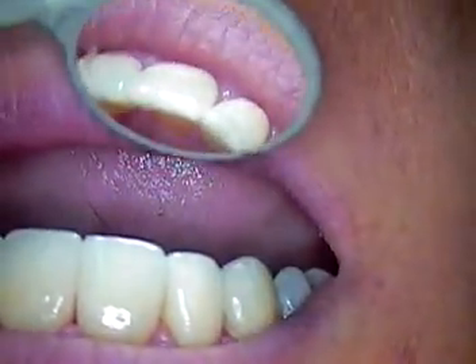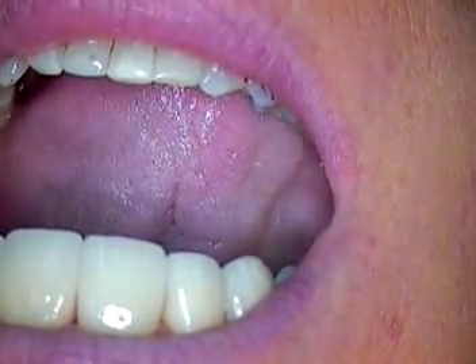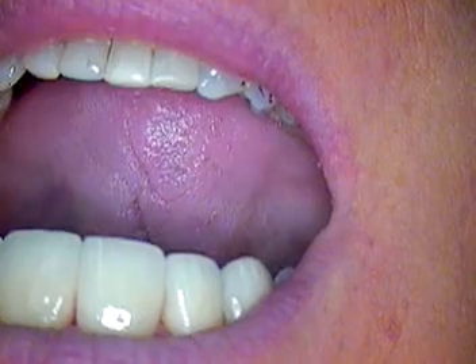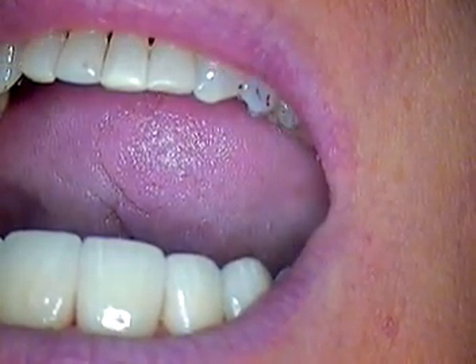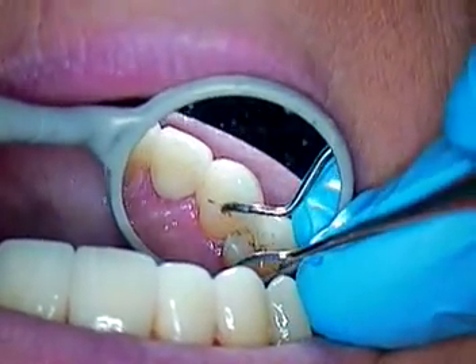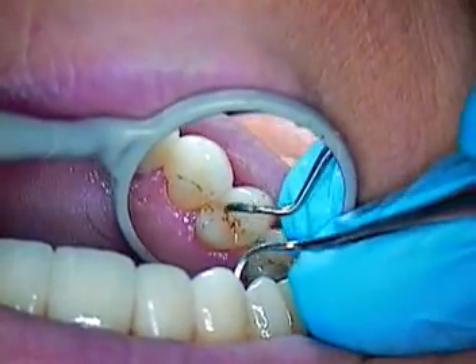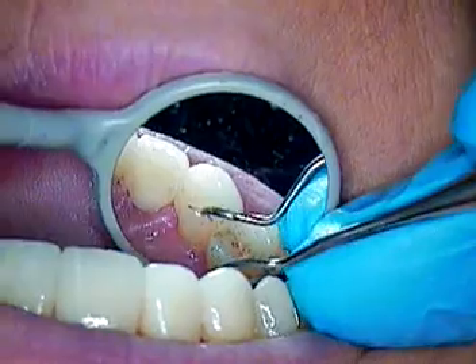We started roughly 1:10 today, and it's right around 3:30 to 3:40, so it's good time spent. We did a lot of double-checking and bite-adjusting here, most of which was probably cement on the natural dentition that we were finally able to get equilibrated.